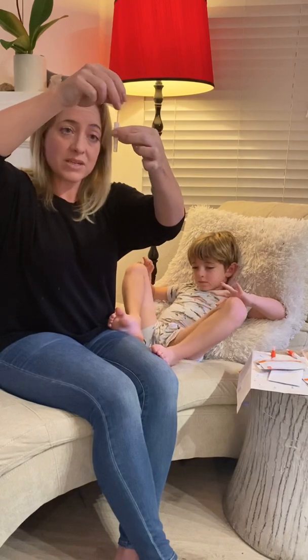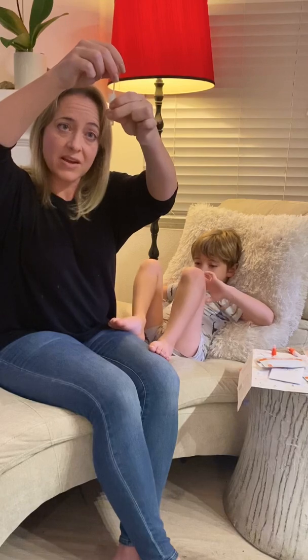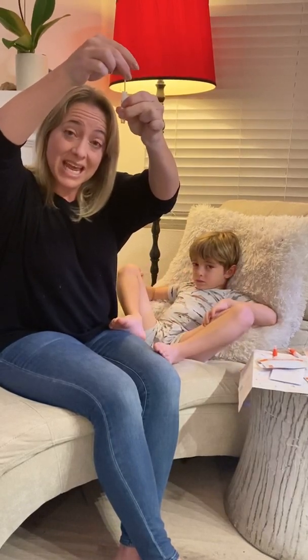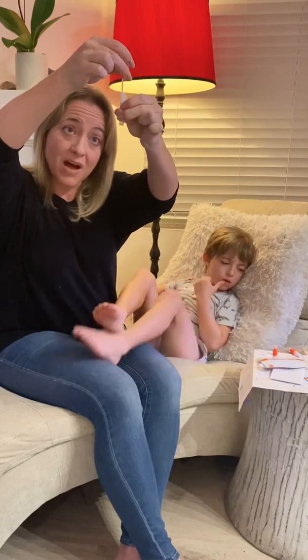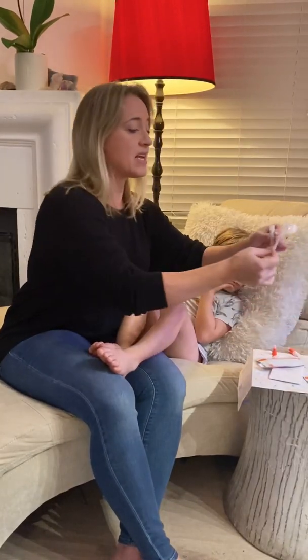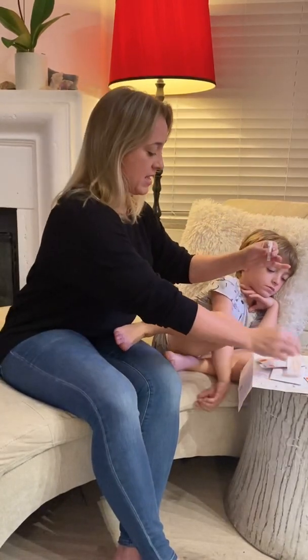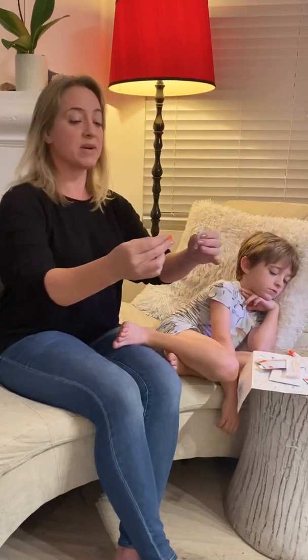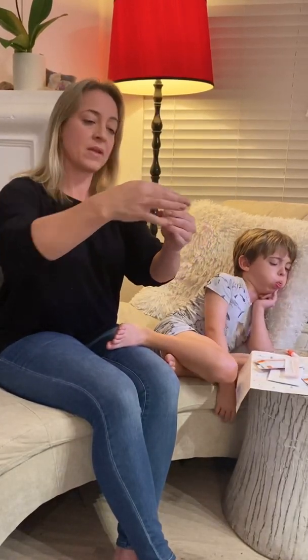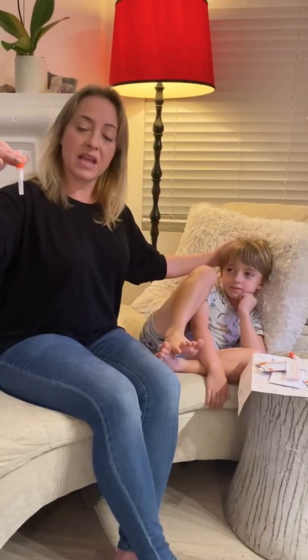Now this part's important. You're going to take the swab and lift it up slightly to the area where you pinch, and pinch and twist there to get any more of the sample off before removing and discarding it in the container it came in, so that we don't spread any more virus or bacteria. Then put the top of the tube back on — again, we don't need to shake.